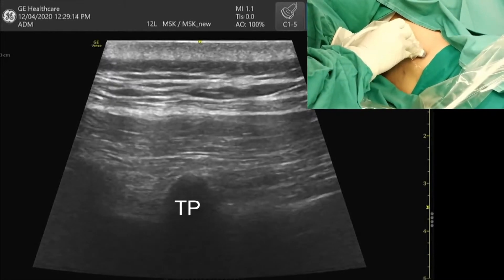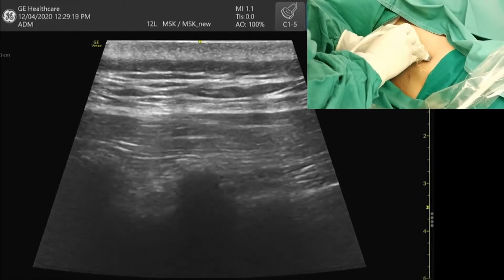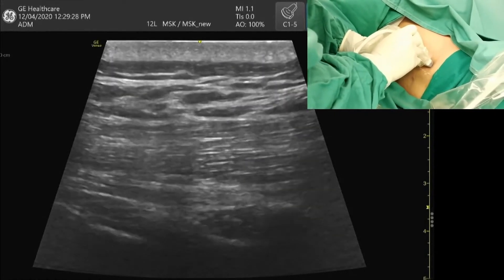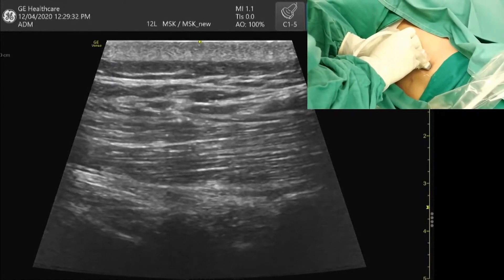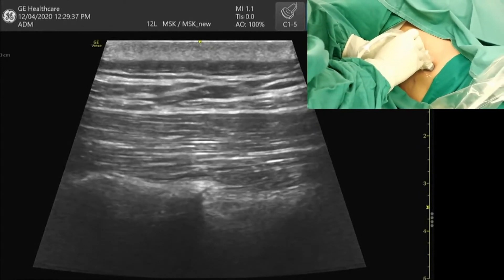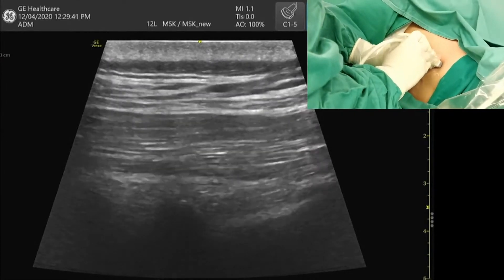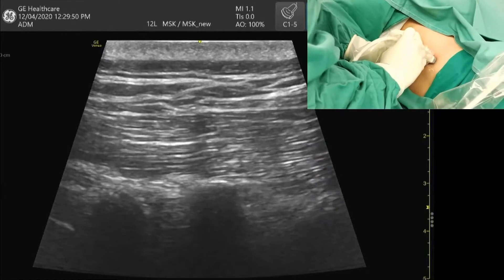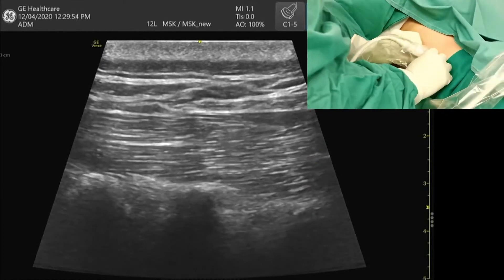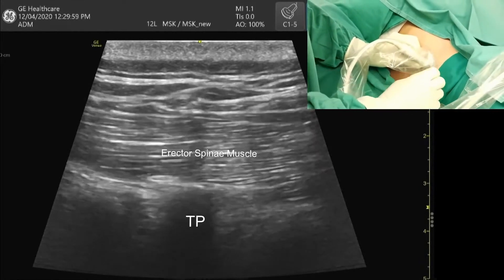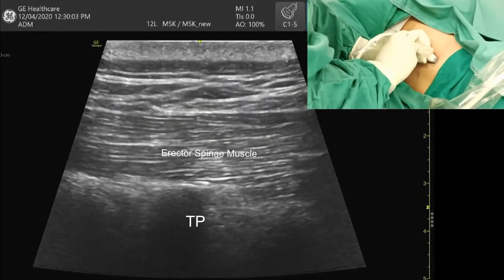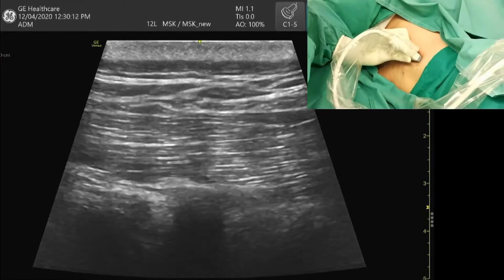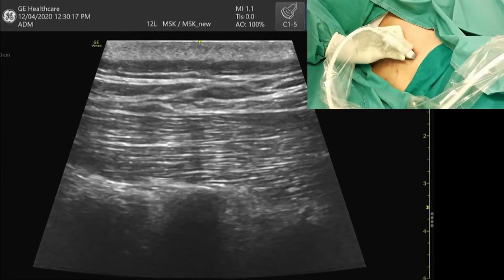This is roughly the image of the transverse process. However, if you slide your probe too medially, you will encounter a flat structure at depth — that is the lamina, meaning you are too medial, and you have to slide the probe back slightly lateral. At this level, the transverse process is visible, and above it is the erector spinae muscle. At the thoracic level, there are only two muscles above the transverse process — the erector spinae and the trapezius. Above thoracic 5 we can also identify the rhomboid, but at this level the rhomboid has already inserted at the T5 region.